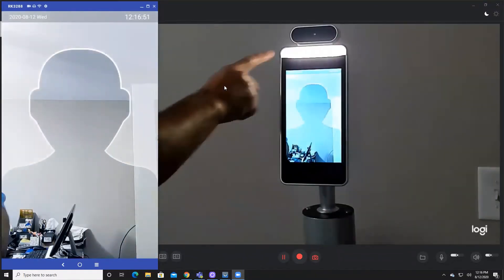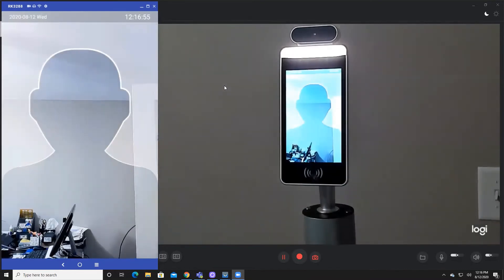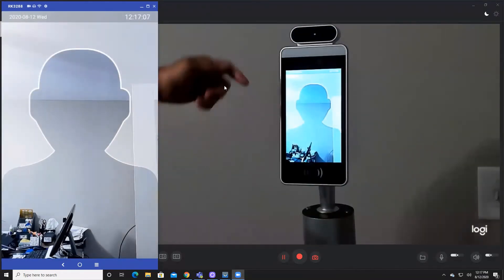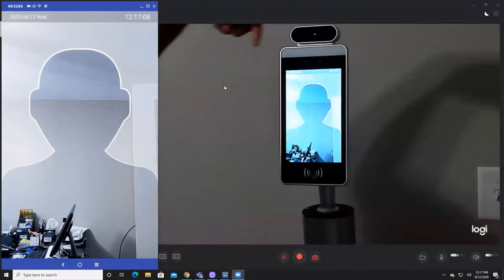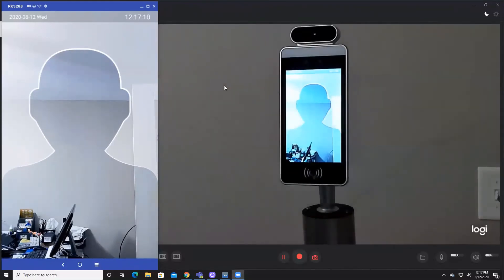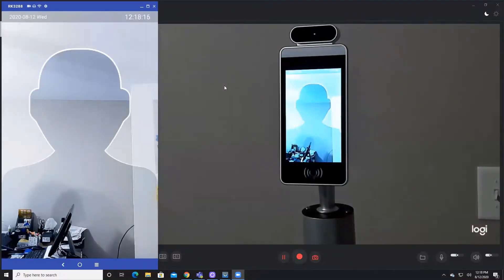The light bar turns red, and then you have the statement across the banner. You could turn on a siren, and the device has a speaker that will emit a siren sound if you want to choose that setting.